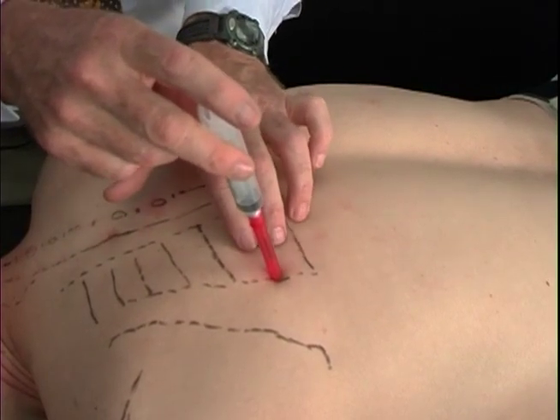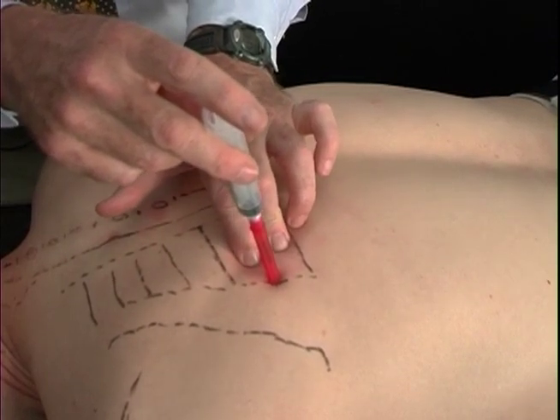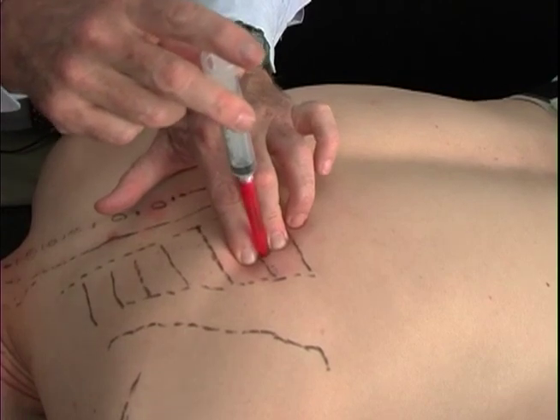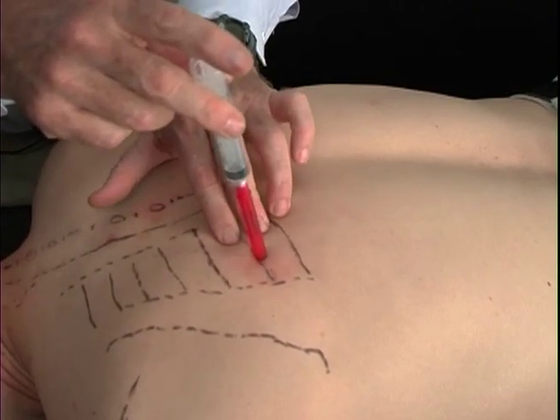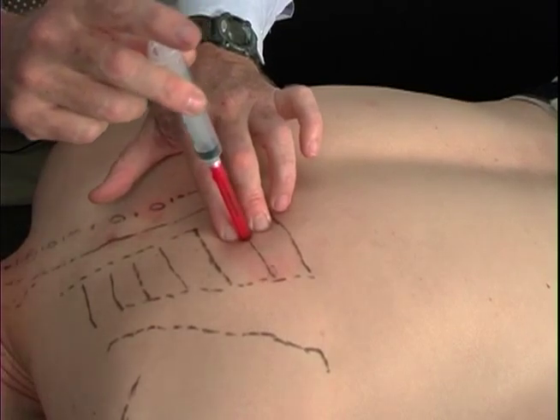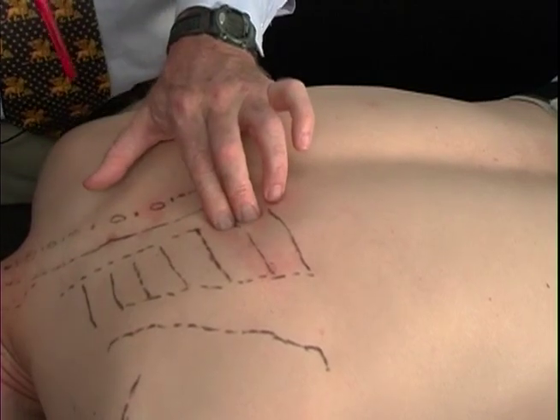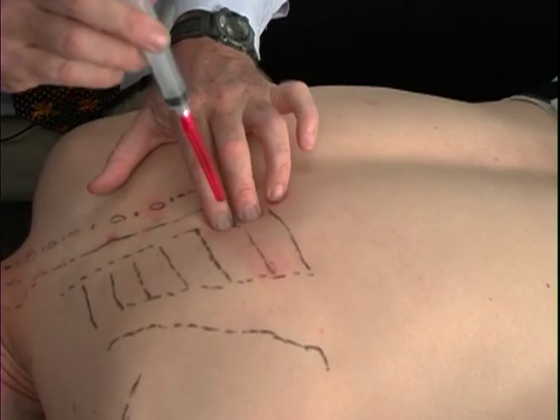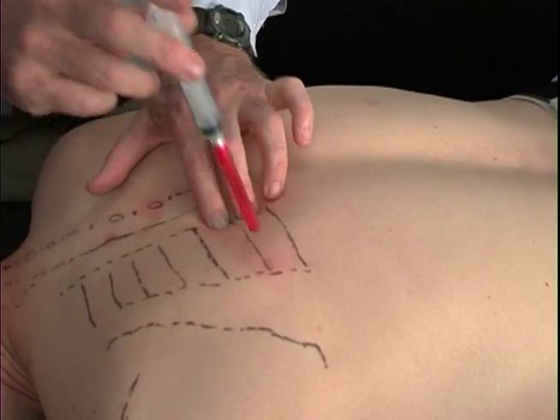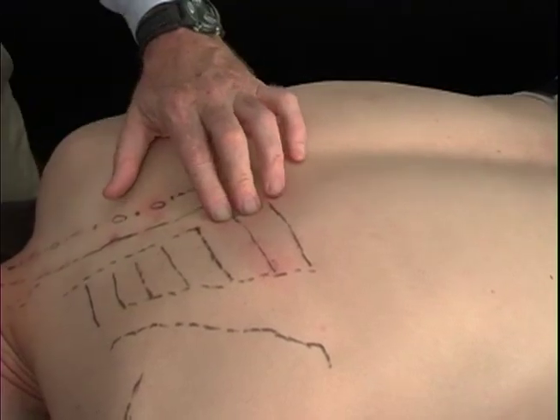We then move our fingers medially, and I'm on the rib and I have it locked between my fingers, come back out and do another injection there. We move right on over, and I've got the rib locked between my fingers, come in and do another injection right on the rib there. And finally, we're now over at the point of the rib transverse process junction. We come in with our final injection right there. So it's about 4 injections across that area, following that rib across.